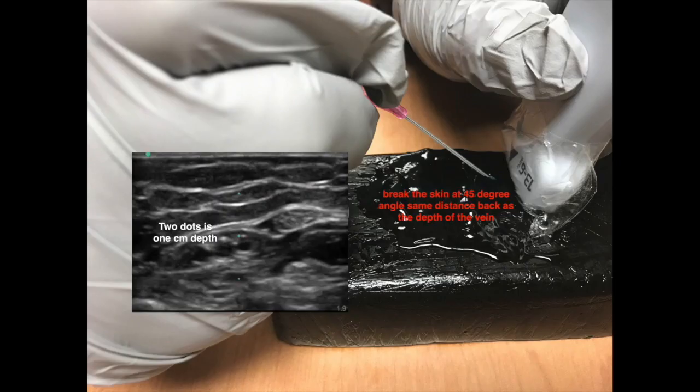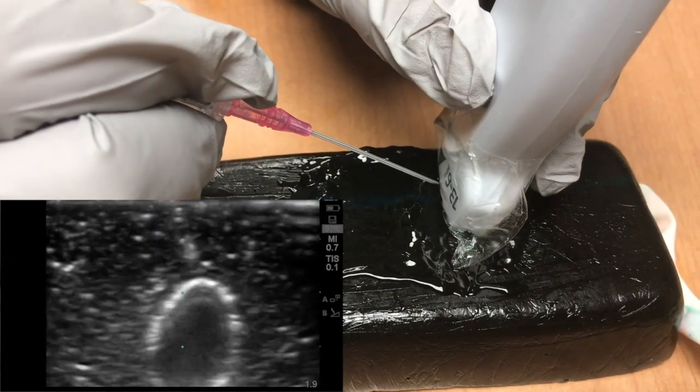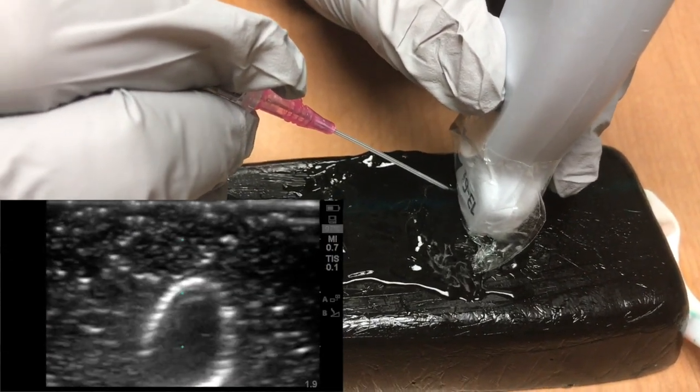Break the skin at a 45 degree angle the same distance back from the probe as the vein is deep. After you break the skin, you must locate the needle tip at all times. This is a two-handed, dynamic process using the ultrasound probe and the transverse view relative to the vein of choice.